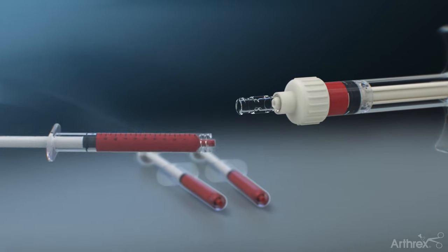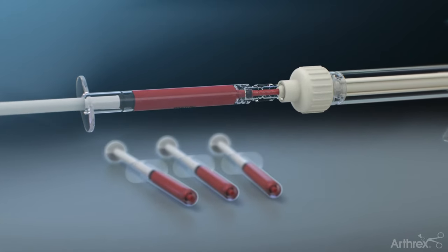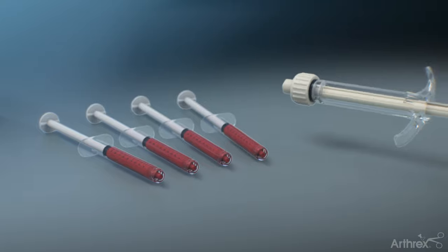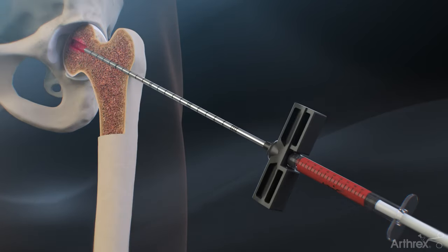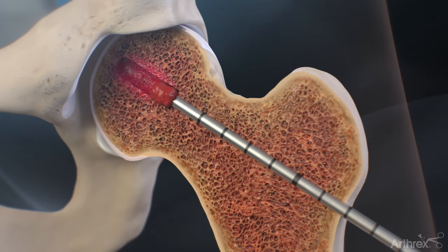The BMA and AlloSync Pure mixture is then transferred to multiple 1cc syringes and delivered into the lesion by backfilling the tunnels created by the drill and decompression devices.